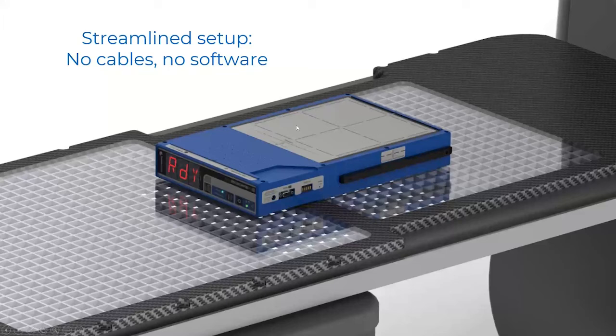They simply get the front white surface set up with the ODI to 100 centimeters. They turn on the collimator lights, and you notice that the 20 by 20 outline here is indicated with a broken line. This makes it very easy to see on the shadows. We found over the years that a white screen with black lines and broken lines makes it very easy for you to identify that you've got that lined up exactly in a simple, easy manner. We find this procedure, with just a little bit of practice, takes you 10 to 15 seconds. It's very simple to do that.